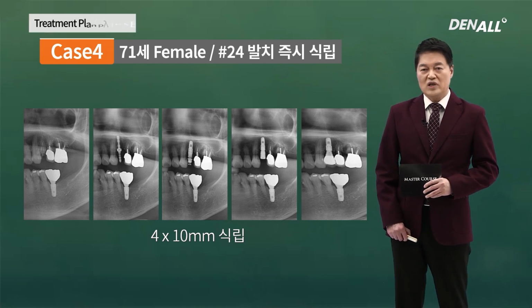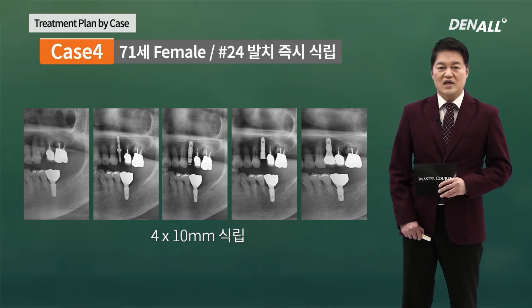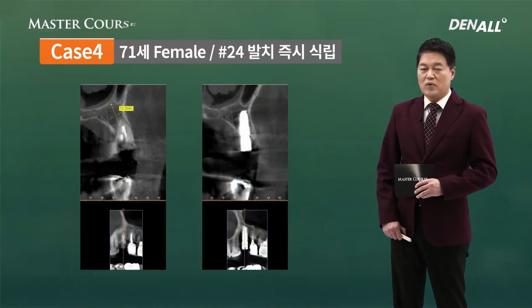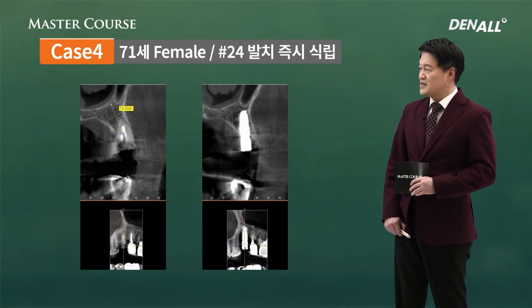Implant was placed to the depths that we wanted and the position that we wanted. Prosthesis was well made. If you look at the CT, buccolingually, bone is very sufficient, and you can see that it is in adequate position.